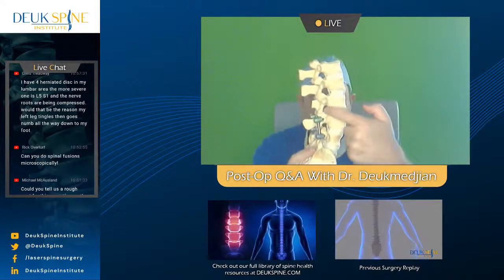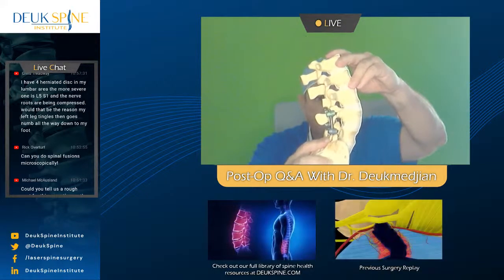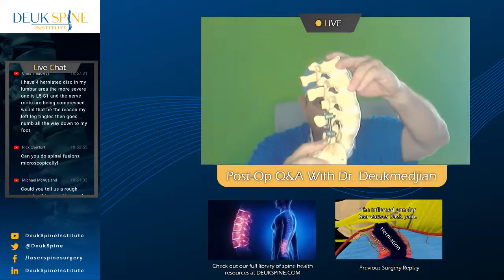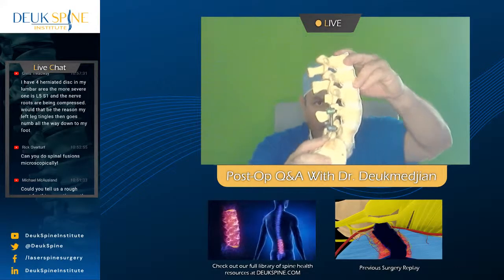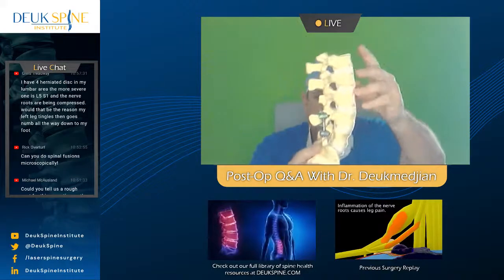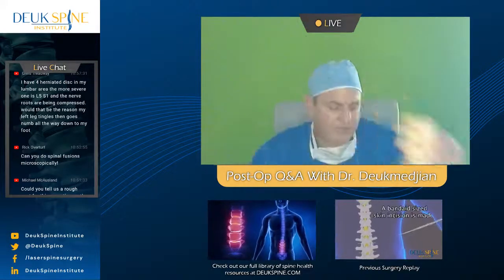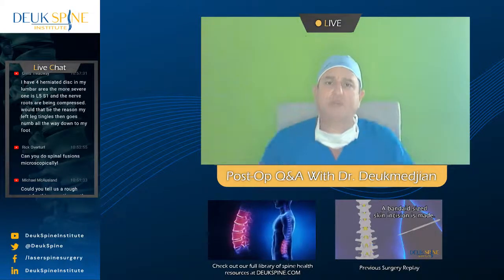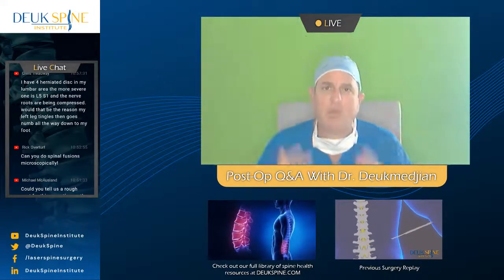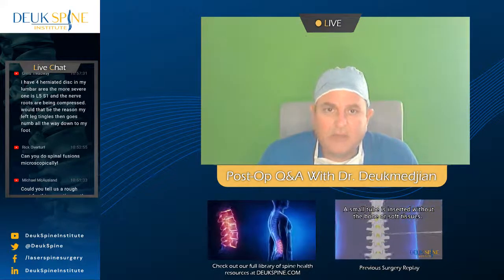Look what happens to the neuroforamen when you correct the deformity and put it into lordosis, which is what you want at the end of a fusion. It narrows that hole. You don't want that hole narrow. That's what pinches the nerve. So before you can correct the deformity into lordosis, you have to open this hole, get the pressure off the nerves, or the patient's going to wake up with more leg pain, weakness, numbness in more areas of their leg, and even on both sides. And that's a bad result, okay?